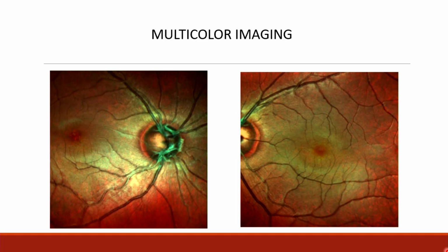In the right eye we can see a red patch over here, and within it is heterogeneous and not homogeneous like in the left eye, and within that heterogeneity, orange punctate spots are visible within that red patch in the right eye, while the left eye appears normal.